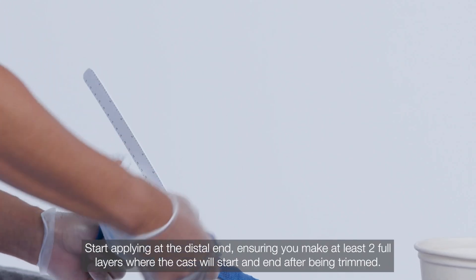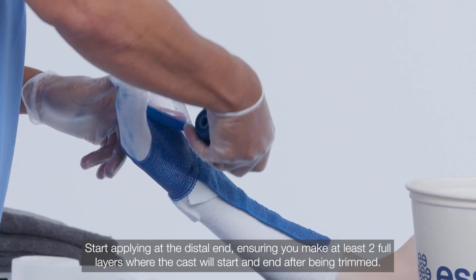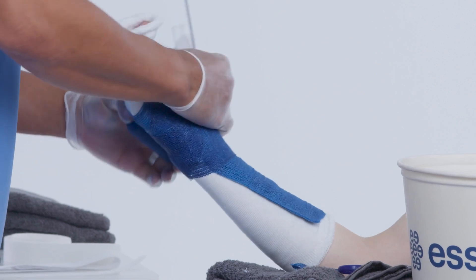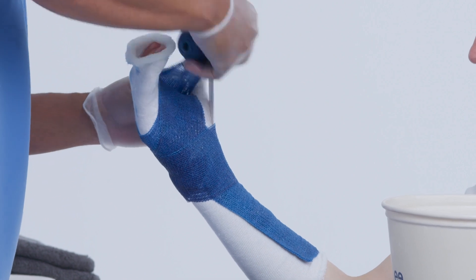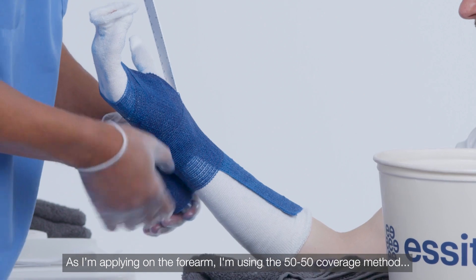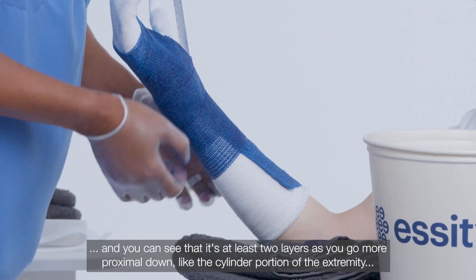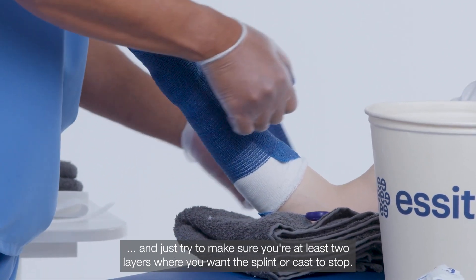Start applying at the distal end, ensuring you make at least two full layers where the cast will start and end after being trimmed. I decided to go through one more pass for better coverage on the dorsal side. As I'm applying on the forearm, I'm using the 50-50 coverage method, and it's at least two layers as you go more proximal down the cylinder portion of the extremity.